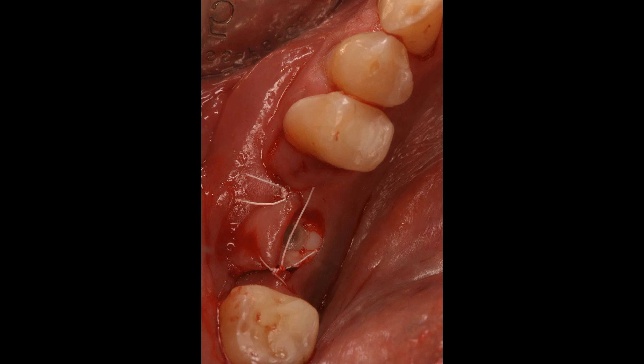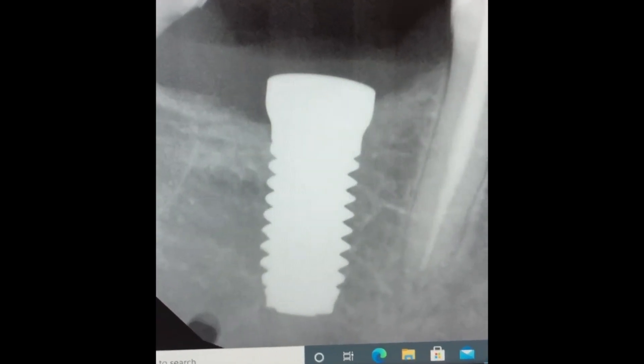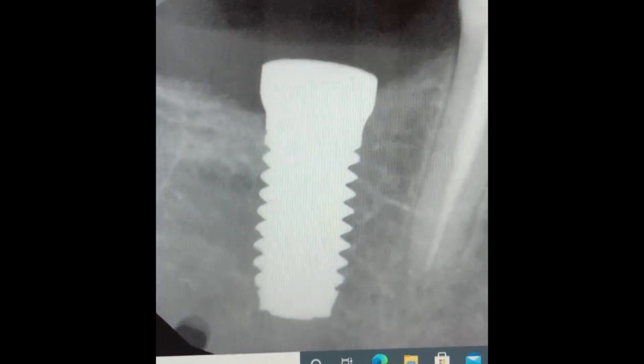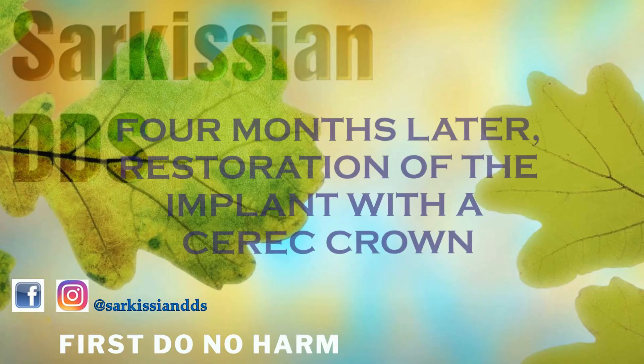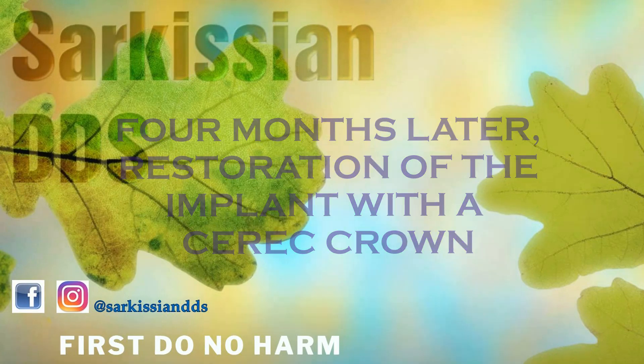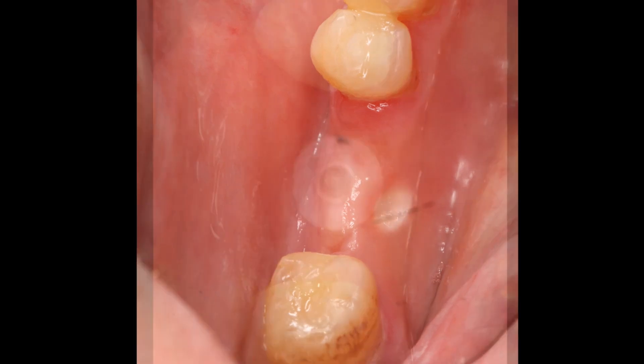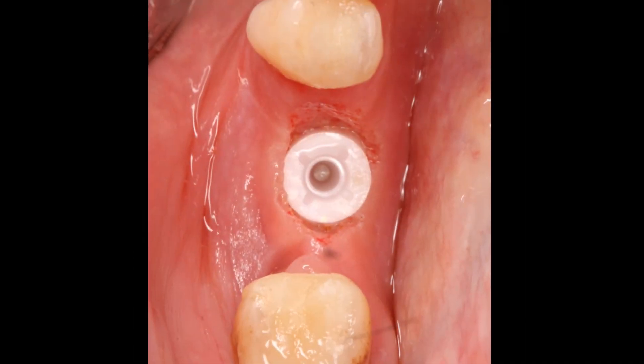During the initial two months of the healing phase, I like to protect the implant site with an Essex appliance or just a modified partial denture if the patient has one. After four months of healing we return to the site, and as we notice, the gums have excellent healing around the implant — they actually grow on the implant and against it.